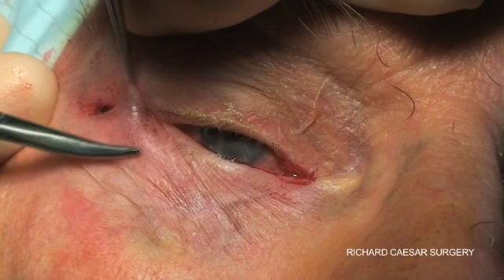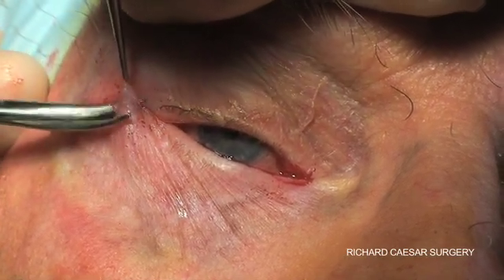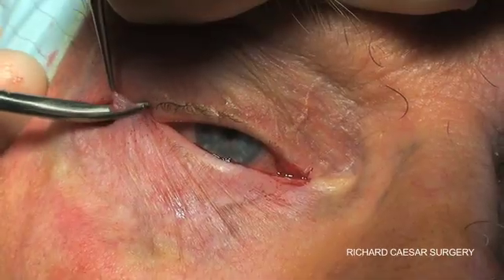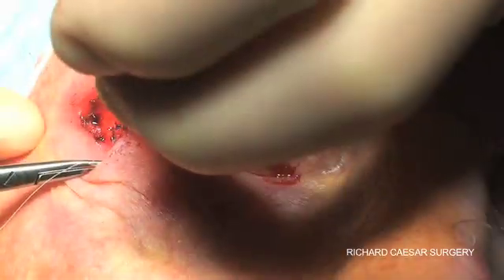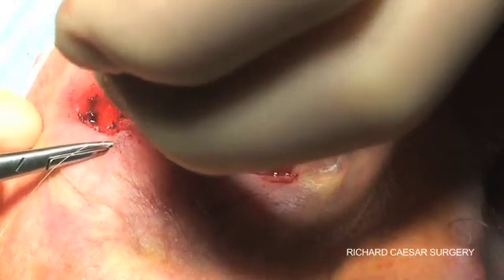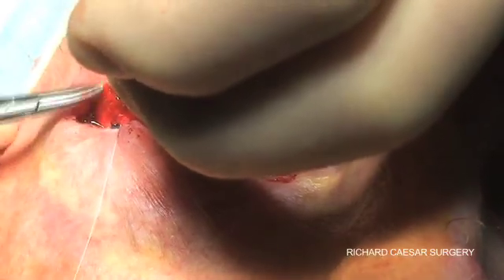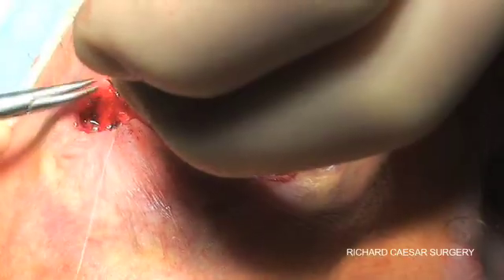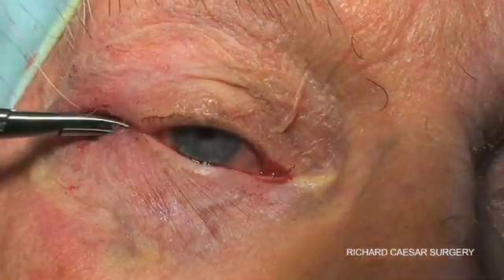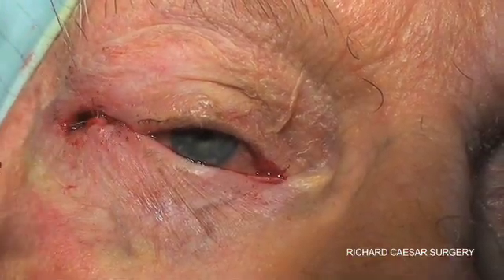The next step is to trim off the excess skin and possibly a little bit of orbicularis surface. Then a deep suture is placed to help cover the proline knot — this is a 6-0 vicryl suture.